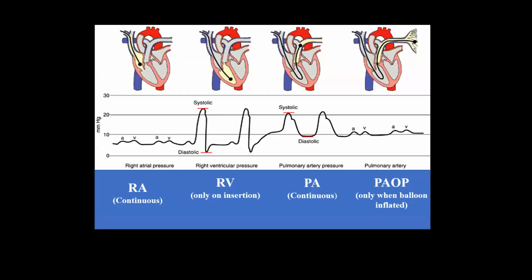So is that solution in the right atrium? Yes. Remember I called that port the proximal injectate. So that's where we inject. And what it needs to do is then go past that thermistor, which is further down in the pulmonary artery. It measures the amount, that 10 mLs, and you've got to do it quickly, over about 4 seconds. If you go too slow, you have a really crappy cardiac output.